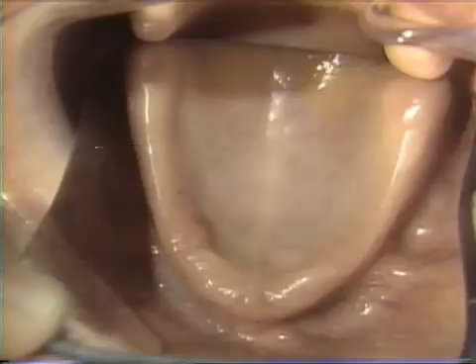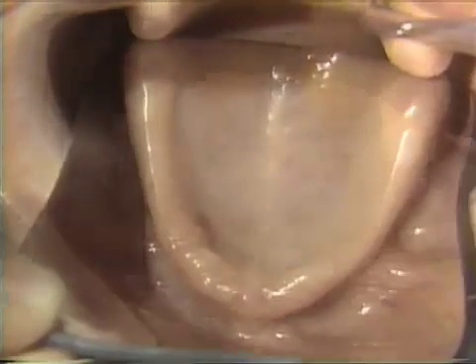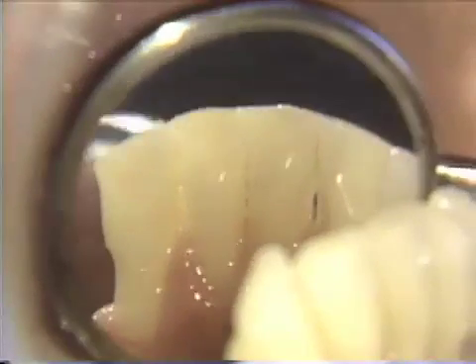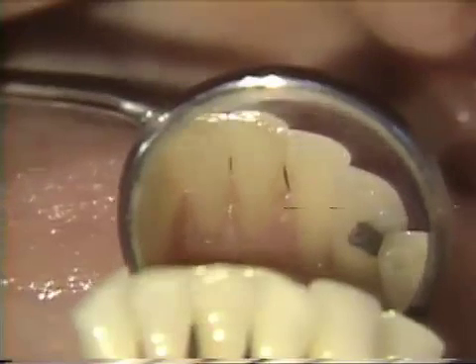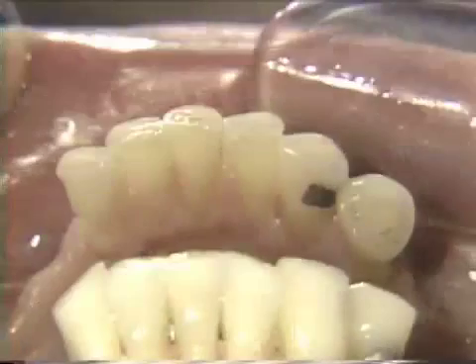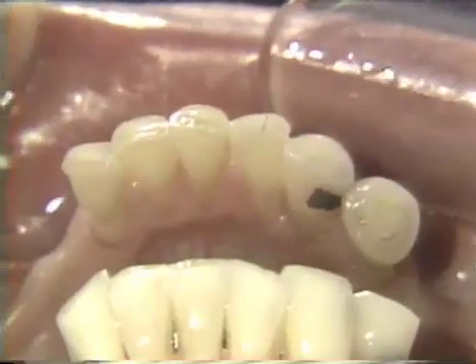The patient is examined for functional and aesthetic concerns. It was decided during the examination to replace both the upper denture and the unsatisfactory lower partial denture. The present partial denture has led to deterioration of periodontal support of the abutment teeth and has been uncomfortable for the patient. Tooth number 27 is lost, and tooth number 26 has extensive periodontal involvement as determined by radiographic examination and will therefore be extracted. The patient expressed the desire to keep her natural teeth, which presents the clinician with a difficult prosthetic situation.